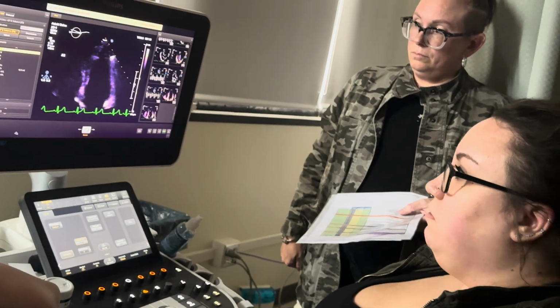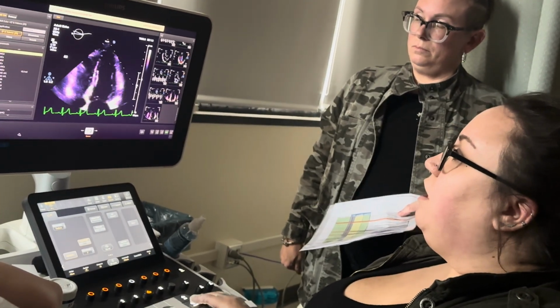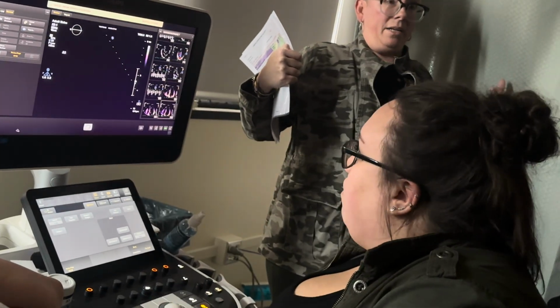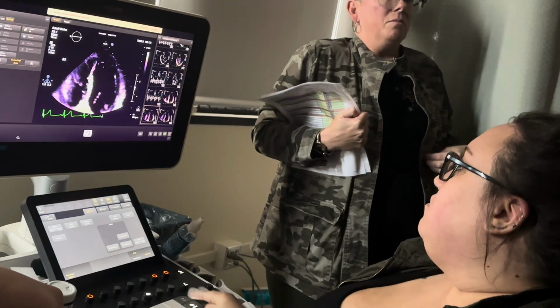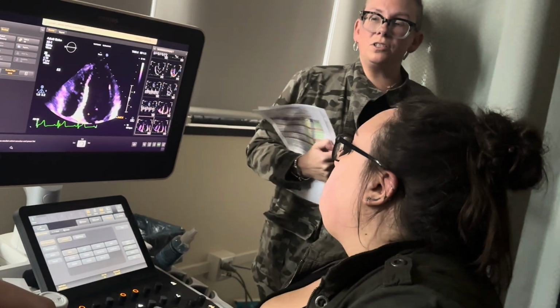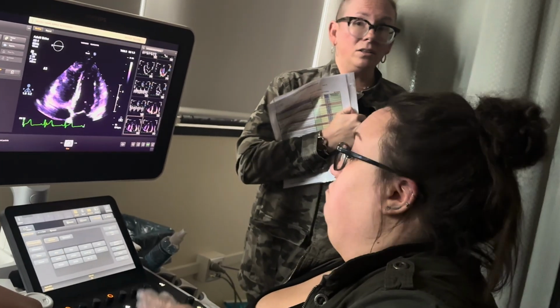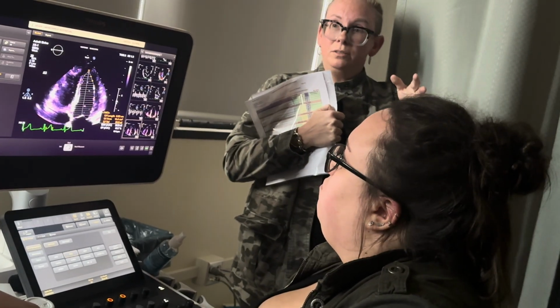So take that breath in again. I'm moving kind of medial, pushing up. I am going more medial. And look at that difference. That is a big difference. Think about when they take a breath in, the lungs go up, and you've got to move in to get your view. So as soon as you have them take a breath in, move your transducer so that you can see it. And if it screws up the first time you do it, try it again. Just keep having them try it until you figure out what the movement is. It's not going to be the same movement on every patient, okay? So you've got to learn how to, yes, the heart's this big, but I've got to move a little bit to try to get a better picture.